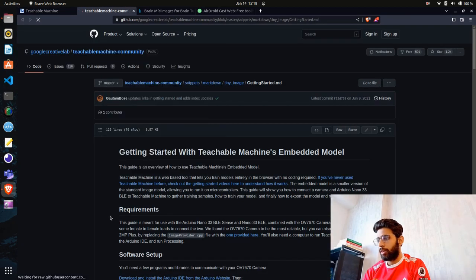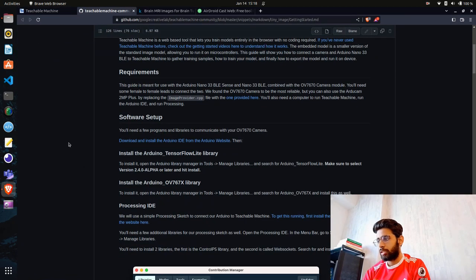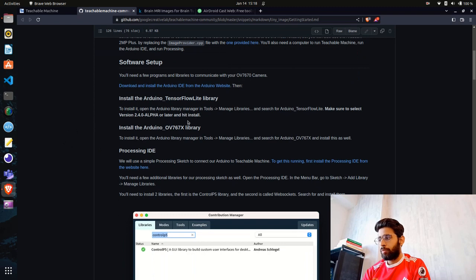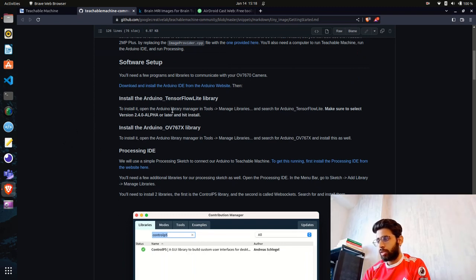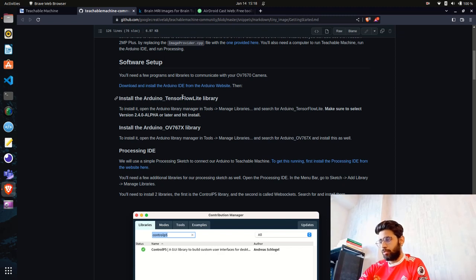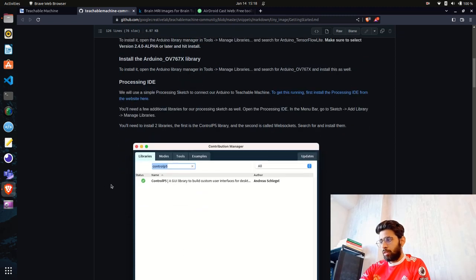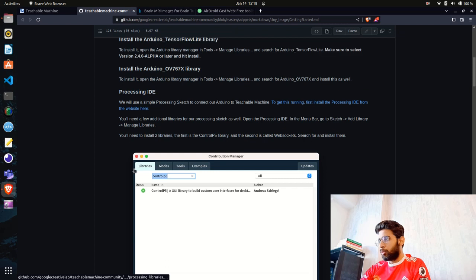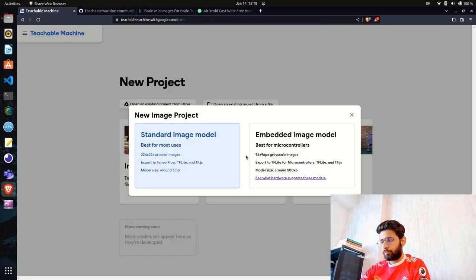If you look at the GitHub repository, the embedded model is compatible with Arduino libraries — for example, Arduino BLE 33 Sense — where you can do TinyML. If you want to do that, select 'Embedded.' I'm going to go with the Standard Image Model.